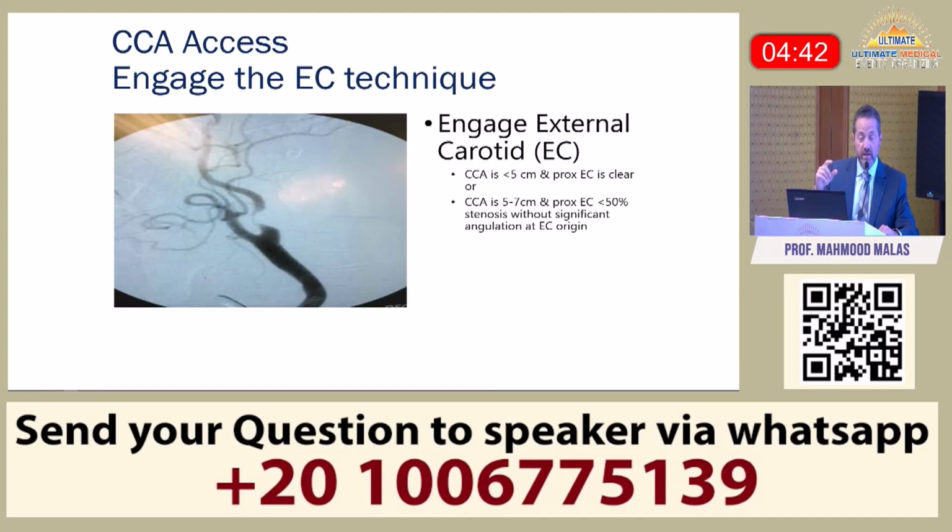If the external carotid artery is healthy, and if the landing zone is too short, I like to get my micro wire and sheath into the external and get myself an additional centimeter or 2. Remember, when you do any intervention in the groin, you have your wire and sheath 50, 60, 100 centimeters inside the patient. Here, your wire is only 2-3 centimeters into the carotid. So very easy, you can lose access, very easy you can dissect if you don't really pay attention to what you're doing.